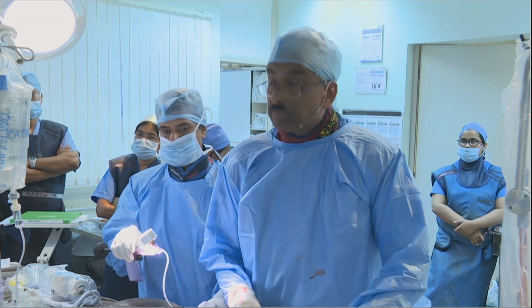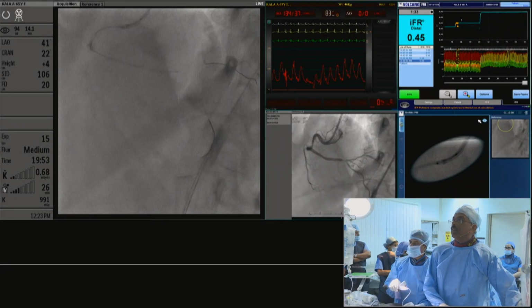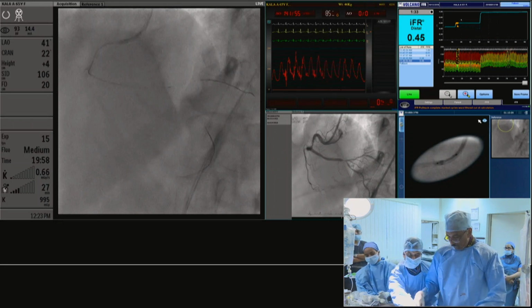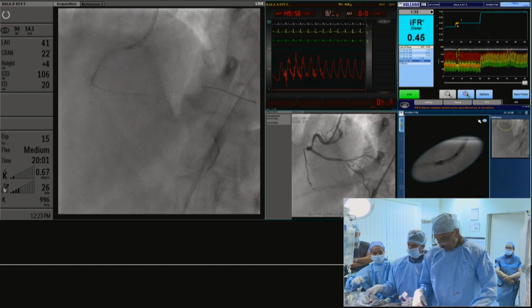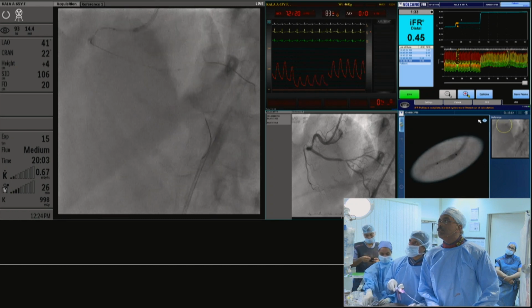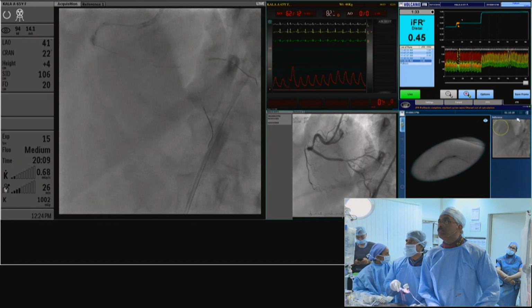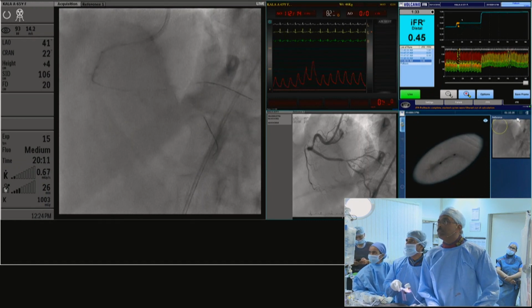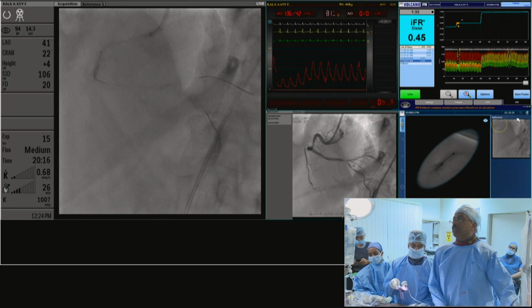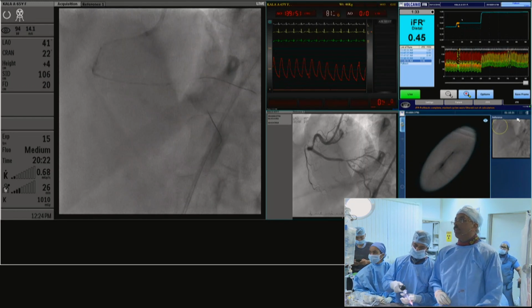I think for the people around, it's a very useful point that has been raised. If you get these extra support wires down, actually, in my practice, if I don't do imaging, I will just take a Grand Slam wire along with that, to straighten the RCA in the mid part, number one. If it is not possible, I try to take a guideliner or a Guidezilla inside to the mid distal RCA, then only I take the stent if I don't do a rotablate. So we've got the angiosculpt there, and we're going to go up there. A very relevant strategy.